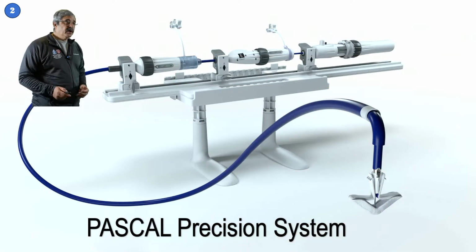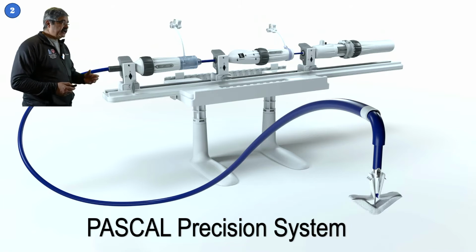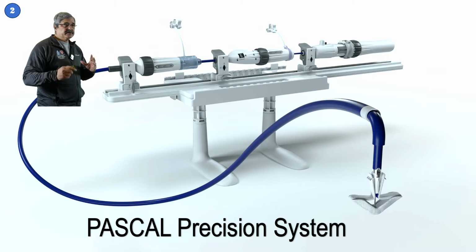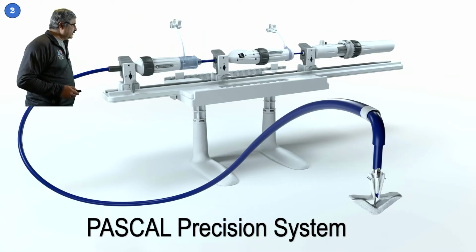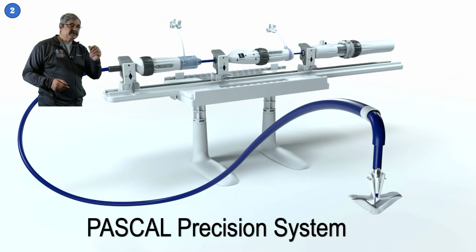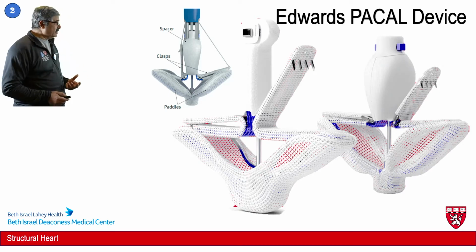Now, while this was going on, in about 2017 and 18, came another player in town, and that's the Pascal Precision System by Edwards. As you can see from its design, it is pretty much based on the same principles of having the ability to change the position and the orientation of the device in the intracardiac space. And they had similarly a catheter steerable guide sheath that went through the femoral vein into the IVC, into the heart, and then they had a clipping device at the edge of it. What it is referred to as is a Pascal rather than a MitraClip.